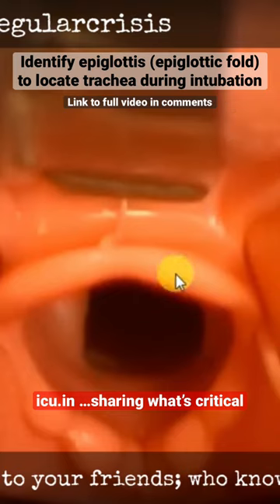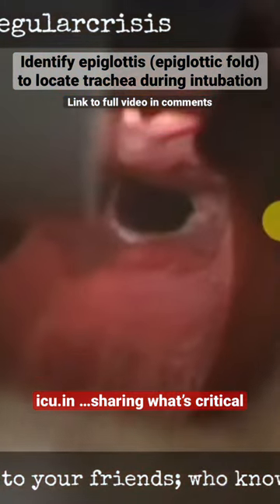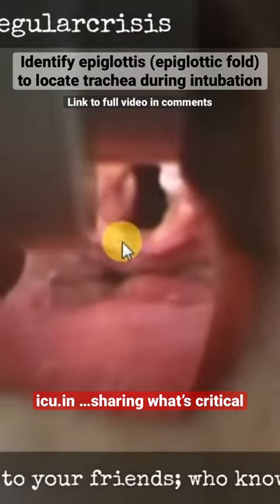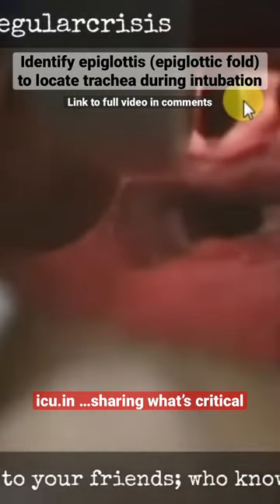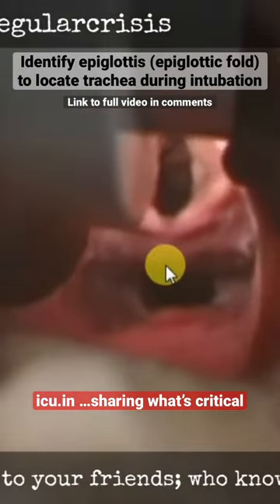Once you reach this fold, you have to lift up the laryngoscope. Now you can see in this video — this is the esophagus, this is the trachea, and this is the epiglottis. You have just lifted up from the epiglottis, and now you are able to see the trachea and esophagus very clearly.